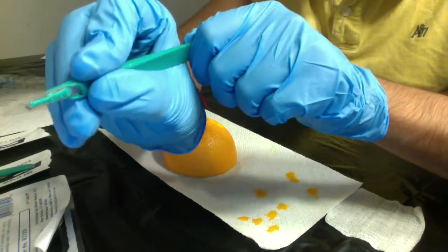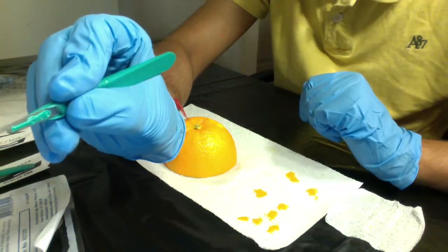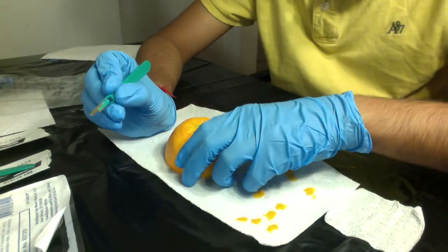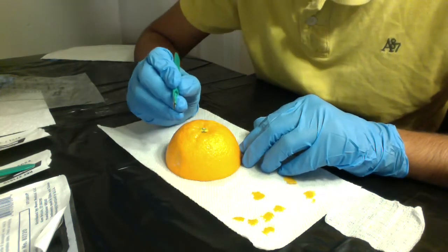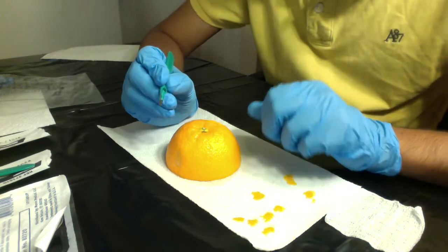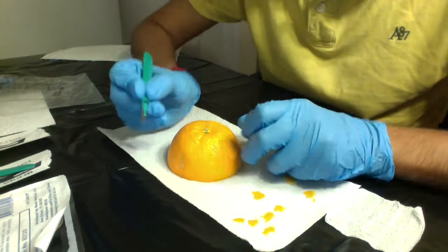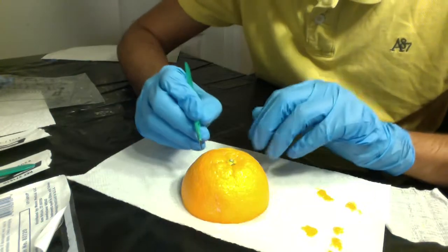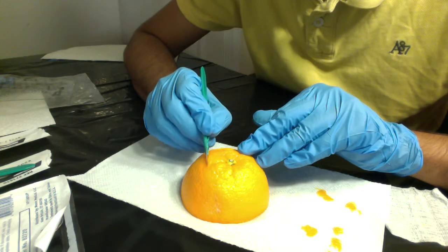It's not moving here, very steady, and just gripping the edge of the shaft so I don't cut my fingers. So for cross hatching, I'll be making 3 cuts, just deep enough but not too deep to injure the viable tissue, using the pencil grip, number 15 blade, my hands are supported.